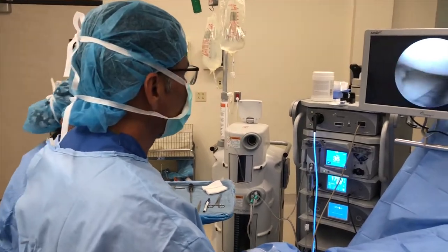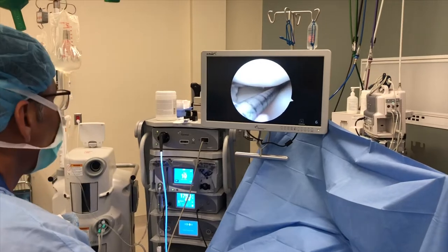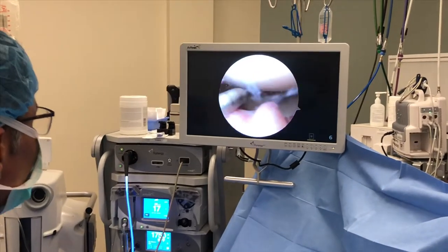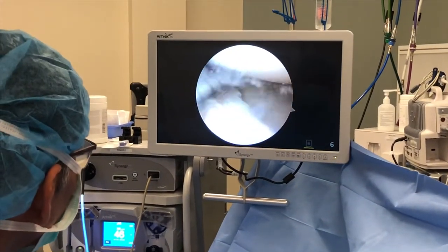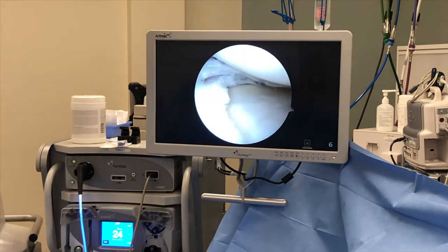Hi, Dr. Moore. So I'm doing the knee scope under local right now. I have the probe in the knee. You see the probe there? So I'm going to actually show you your meniscus tear.